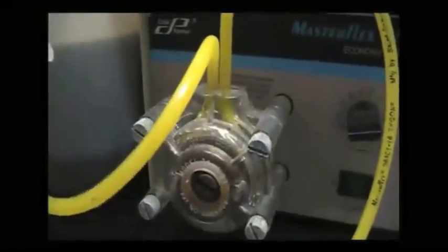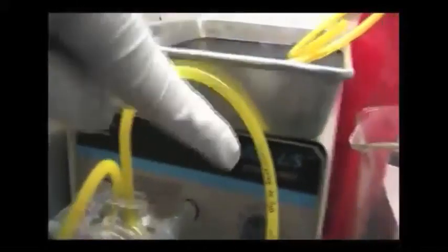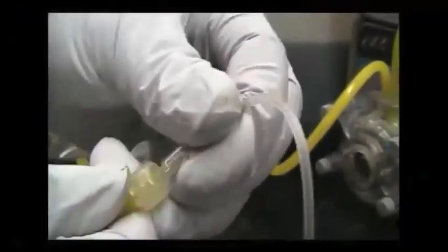Then it will go into the machine, go around this hinge right here, and then come back out and lead to the animal. We do not want to shoot a bunch of water, or solution, into this animal; we want to be able to control it. So we do this by attaching a syringe and a little bit of hosing to the end of our tubing. At this point in time, the needle is covered because we want to worry about safety, because it is very sharp, and I will take that cover off and then we'll be ready to go.